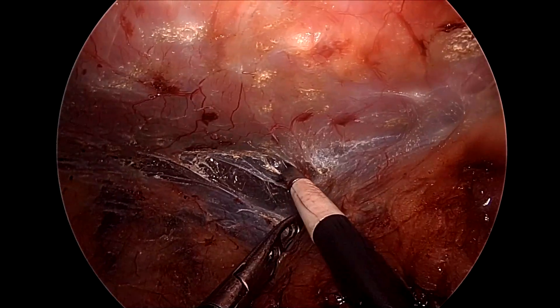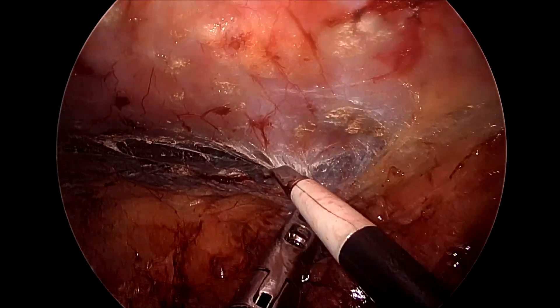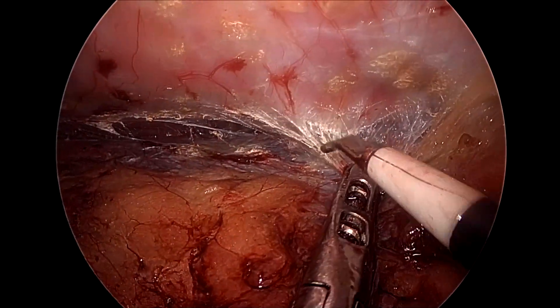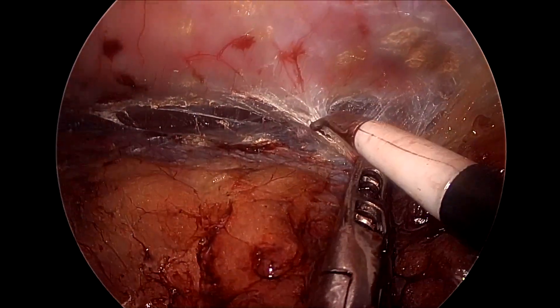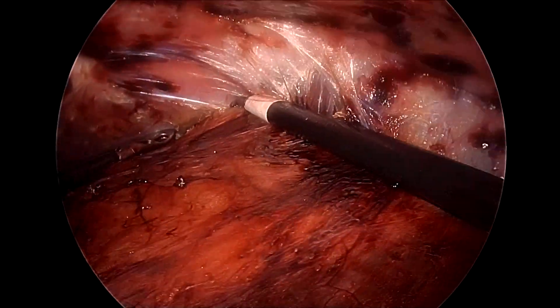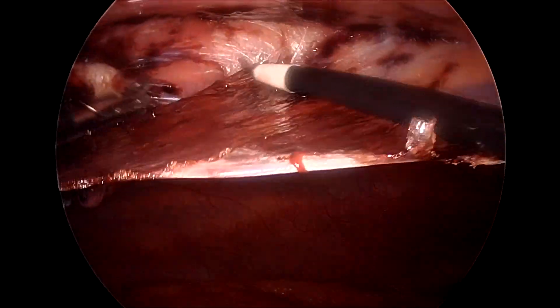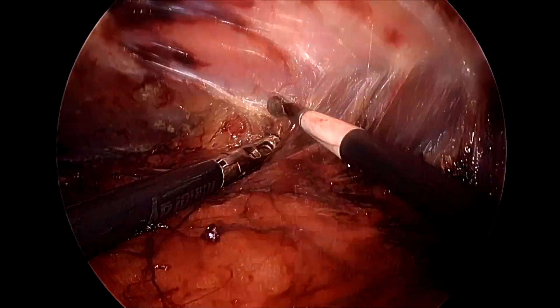Here we are taking on the transversalis fascia fibers and keeping onto the peritoneum surface. Sometimes it is very difficult and what we can do is just graze around the posterior sheath. You can use some blunt dissection here as well — a swiping movement which we also call the streaming maneuver.